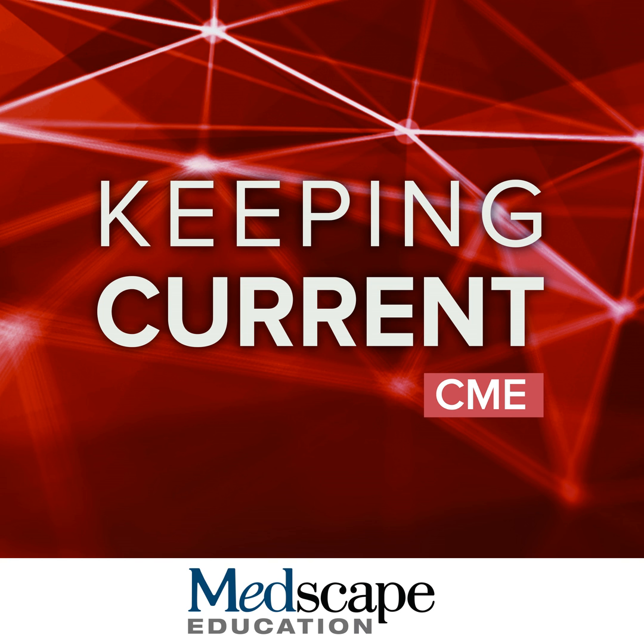And it's important to note that with these protocols, the stress and rest perfusion should be separated by about 10 minutes, and longer if your preference is to also acquire quantitation of myocardial blood flow, which is another feature that is quite unique with cardiac MRI.